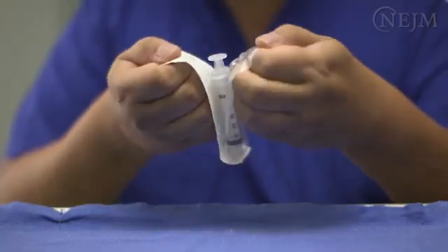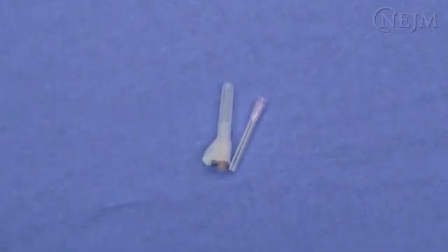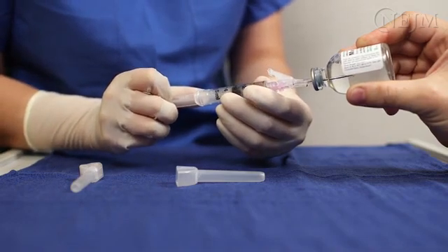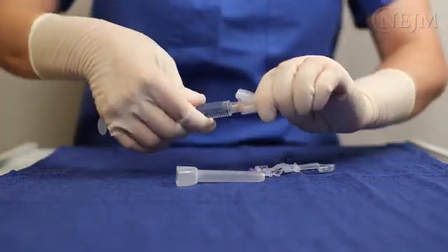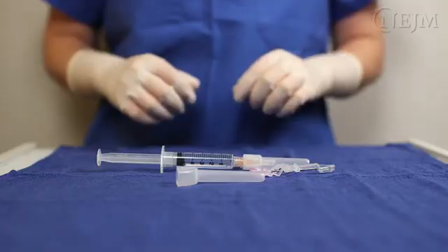Open the packages for the 10 cc syringe, the 18-gauge needle, and the 25-gauge or 27-gauge safety needle. Don sterile gloves. Draw up 10 cc's of local anesthetic with the 18-gauge needle. After the local anesthetic is drawn into the syringe, switch to the 25-gauge or 27-gauge safety needle for performing the injection.